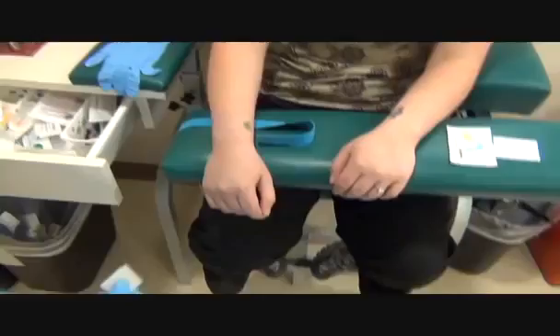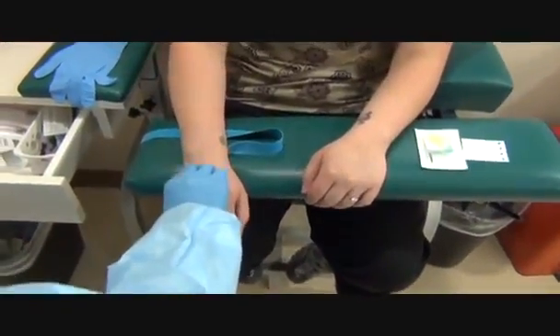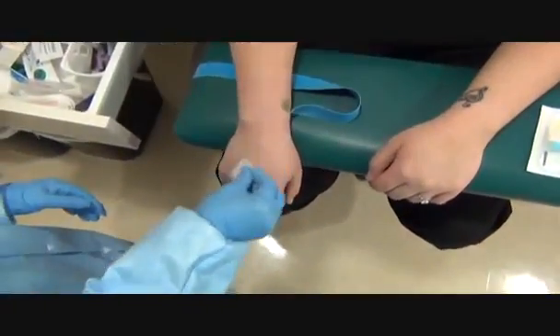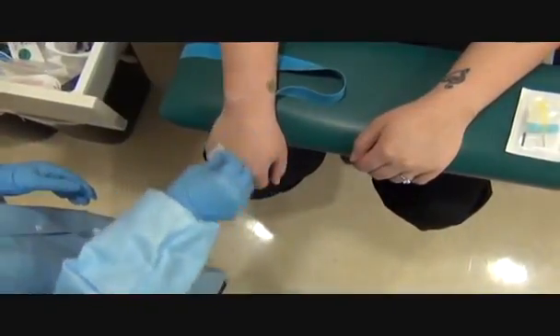Go ahead and open up your hand. I'm going to clean the site. Wipe down once. Flip over the alcohol. Counter clockwise concentric circles moving outward.